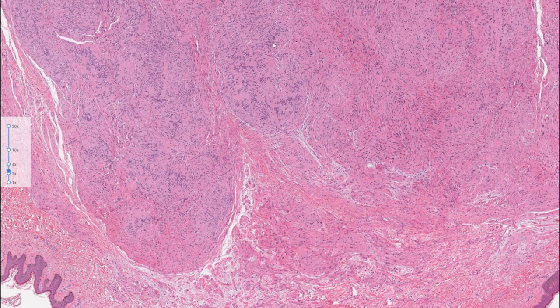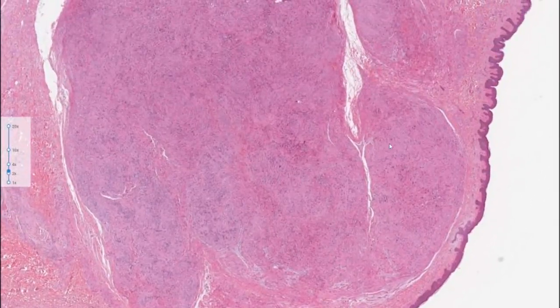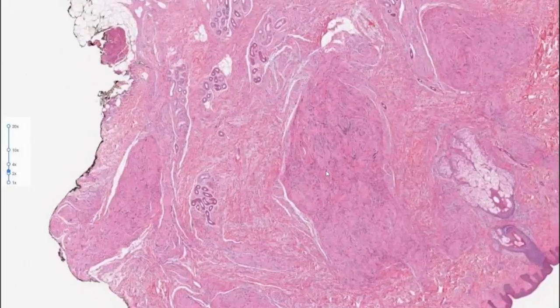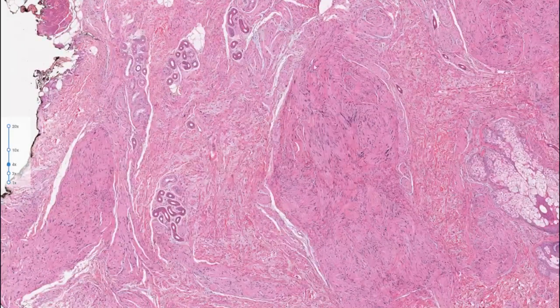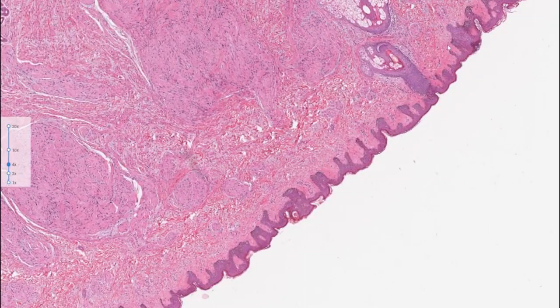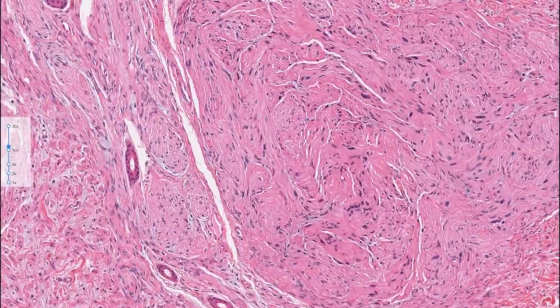What's the distinction? Essentially, every single nodule that you see here, you have a plexiform pattern of growth, but every nodule is a schwannoma almost. It's almost like a distinct schwannoma. You don't have the capsule, but you see it in almost every area. You might have a little bit of internodular Schwann cell proliferation, but almost every nodule here looks like a conventional schwannoma if you go on high power. It's superficial. That's something to have in mind. Many of these are related to skin or mucosa. And the cytology, again, is that of a schwannoma.